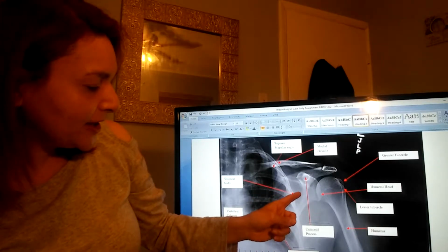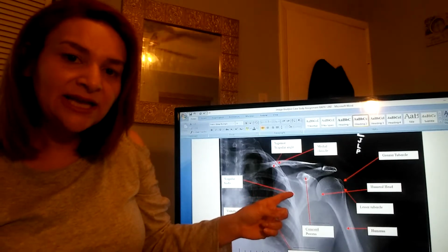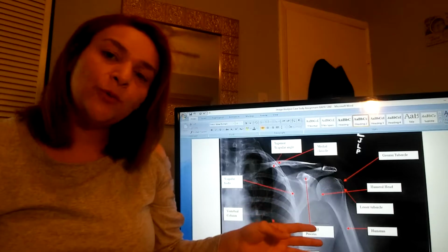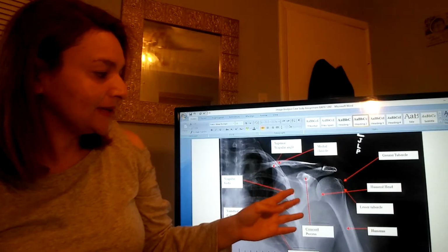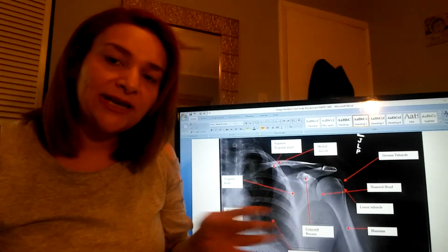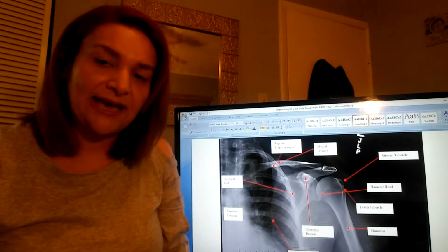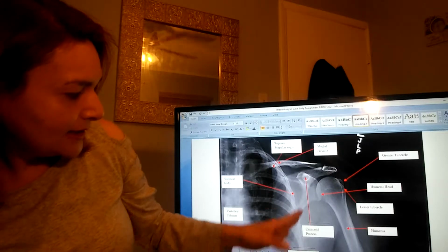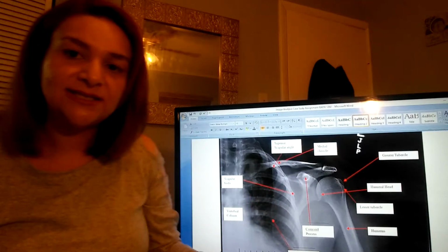I do want to talk about transverse foreshortening and what causes that. Martinson states that when we do an AP scapula projection, naturally our scapula sits at a 35 to 45 degree angle, which brings our lateral border more anterior to the medial, so you get this oblique.